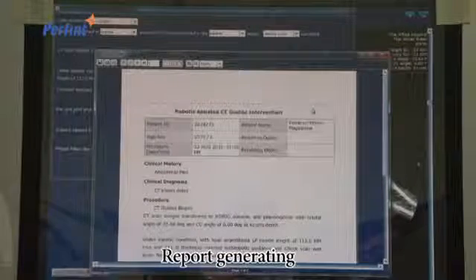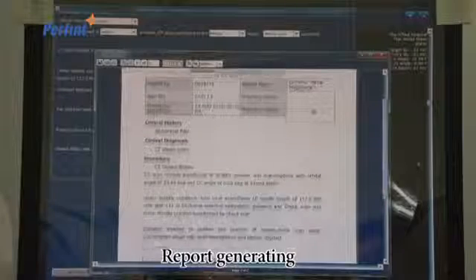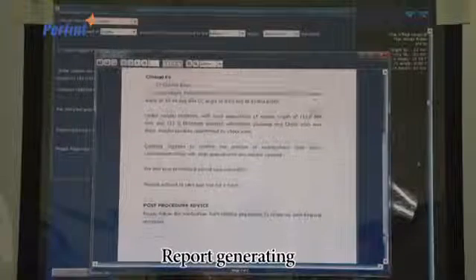And that will generate our report for us that we could utilize and transfer to the PAC system if we needed to.